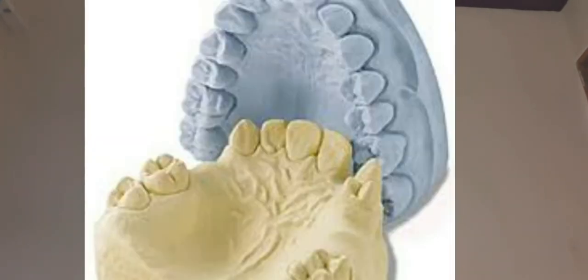Next, ladies and gentlemen, we have gypsum materials. Gypsum materials are basically the materials that we use to make casts and models with in the lab. There are 5 types of gypsum materials. Please know all of them, the 5 types, and know their water to powder ratios. The table is on eTuto along with these 2 presentations, okay? Please study that table and know it very well, because the 5 types differ in a lot of things, be it the water to powder ratio, the dimensional stability, the strength, the resistance, the accuracy of detail, etc. So please just know all of that.